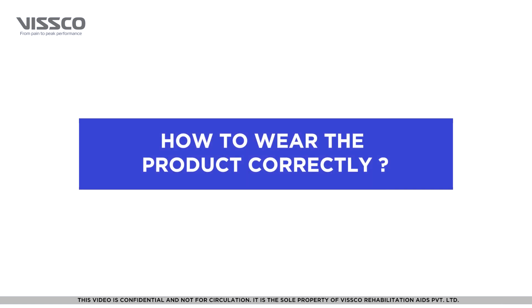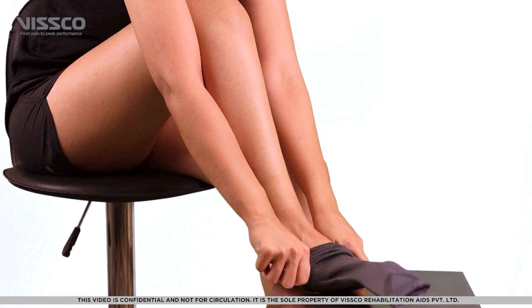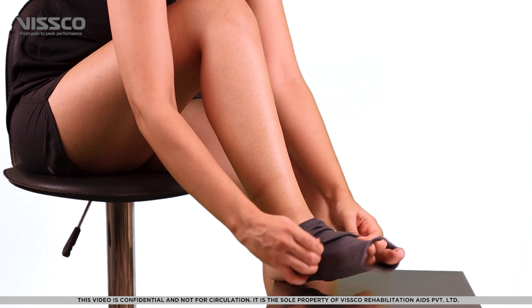Now that you have selected the right size, let's wear the product. Pull the support over your ankle as if wearing a sock.